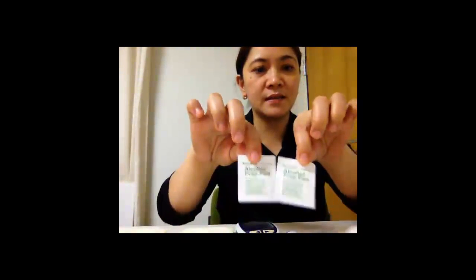The equipment that we are going to use in getting the blood sugar level are sterile gloves, the glucometer, lancet, the glucose strip, alcohol swab to cleanse the injection site, cotton balls, and the plaster or band-aid to be applied at the patient's injection site after the procedure.